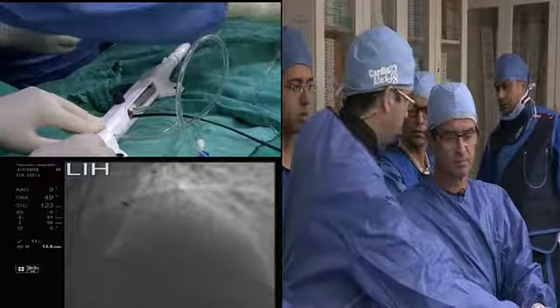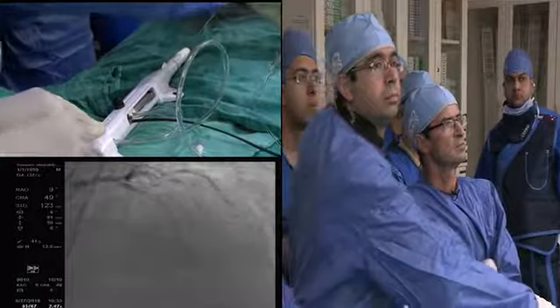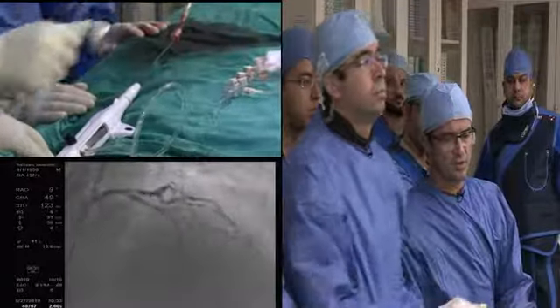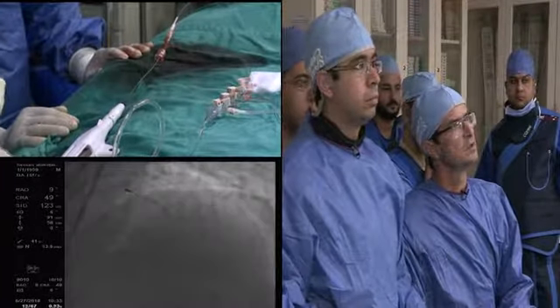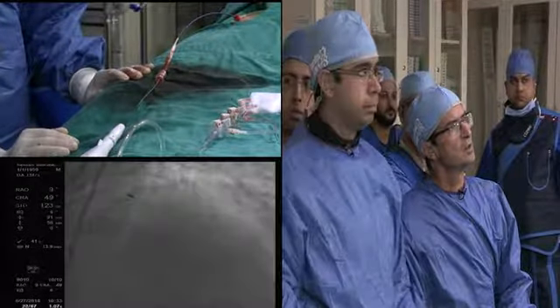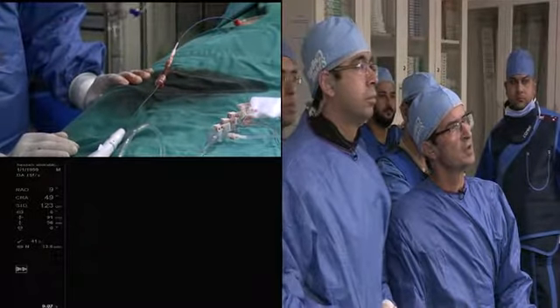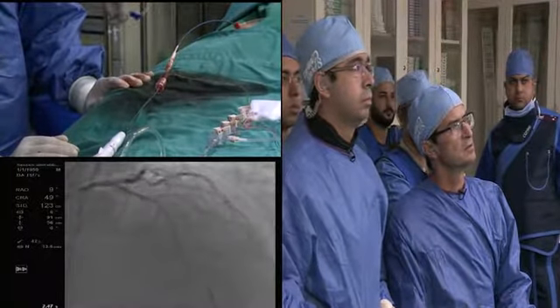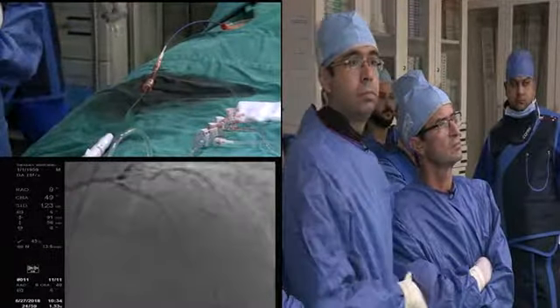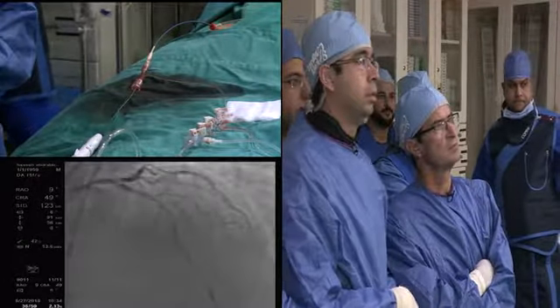I think it is. Post. Okay, Antonio, I think we have finished. I think. Okay. Very good. Now we could put a stent, I think, inside.